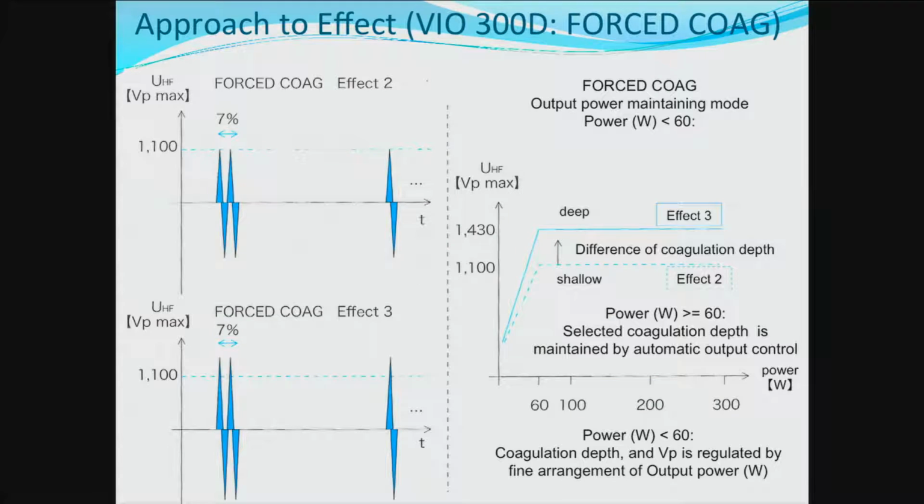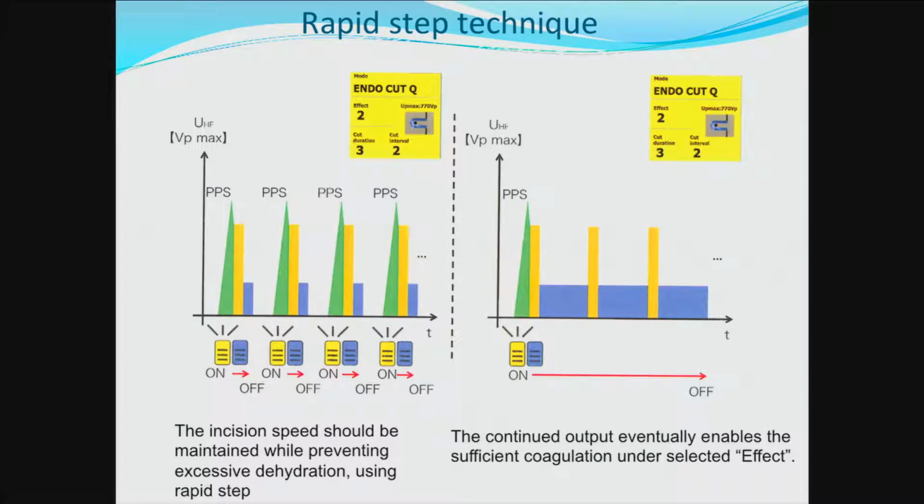The same output wave can produce different electric conduction results by proper application of duration period.